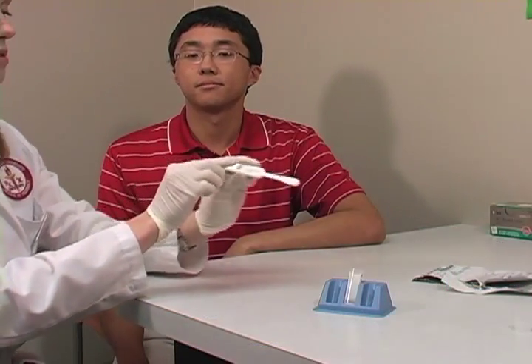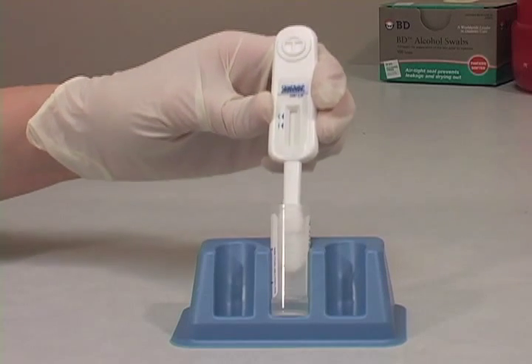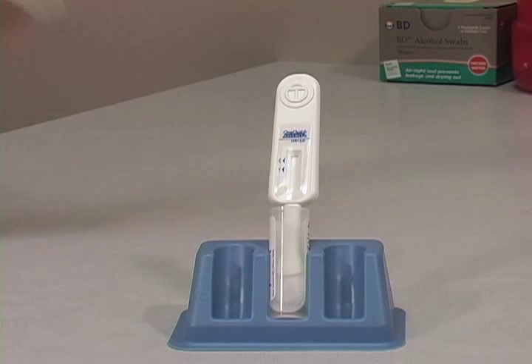The next step is to conduct the test. Insert the flat pad of the device all the way into the developer solution vial. Make sure the flat pad touches the bottom of the vial. The result window on the device should be facing towards you.